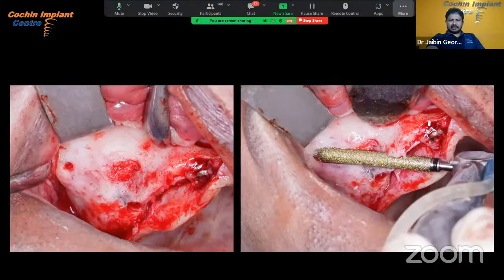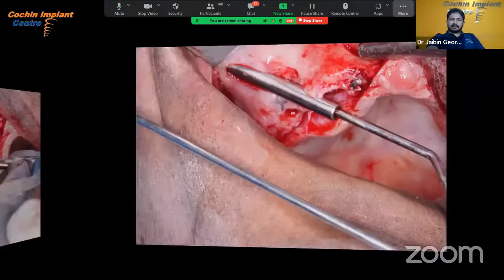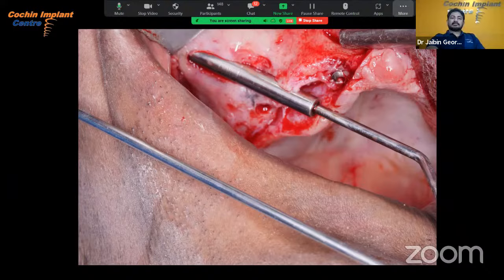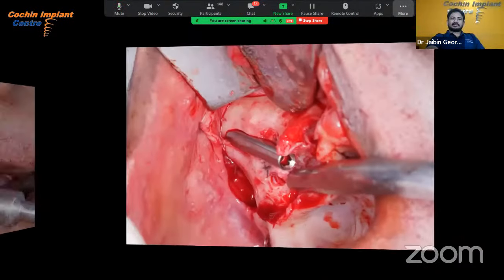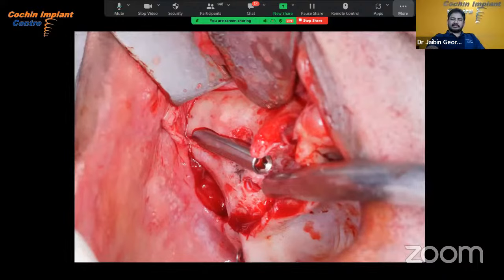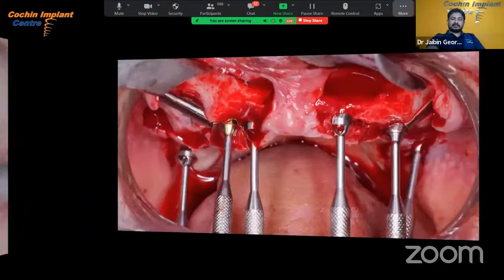We started with the right side zygoma, the diamond drill. Again, extramaxillary approach, zygopath, and the implant is placed with high torque, almost 100 newtons of torque we could achieve.